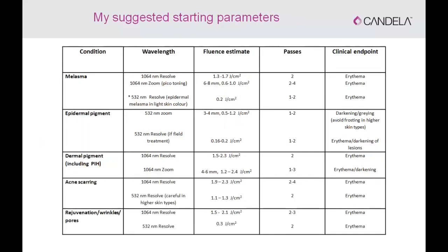For the lighter skin type patients with predominantly epidermal melasma, I also use 1 or 2 passes maximum of the 532 Resolve. Again, you have to be careful using that on very dark skin patients. In that case, I will limit the use to 1064 Resolve followed by the 1064 Zoom. We are going to publish our results and experience with melasma using this combination technique, but this is a technique I have found very useful for melasma.